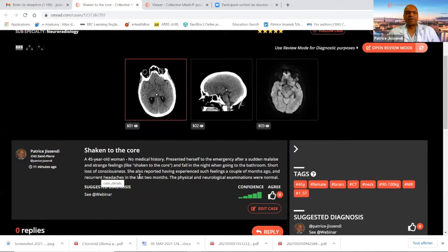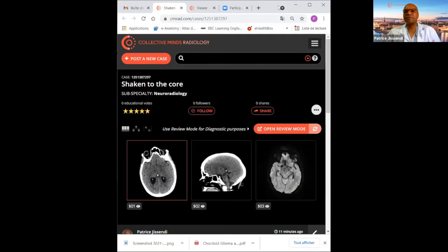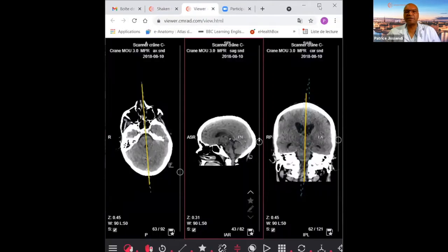And she also reported having experienced such feelings a couple of months ago. She also reported recurrent headaches in the last 2 months. The physical and neurological examination were normal. So I will go now to the review mode window. Give me a second. Okay, there we go.